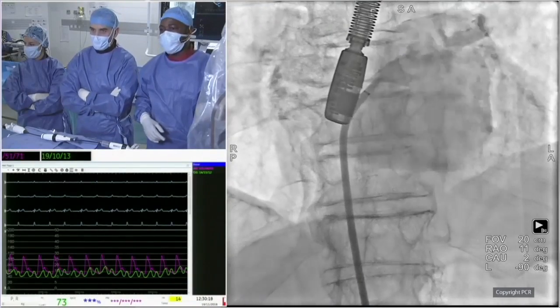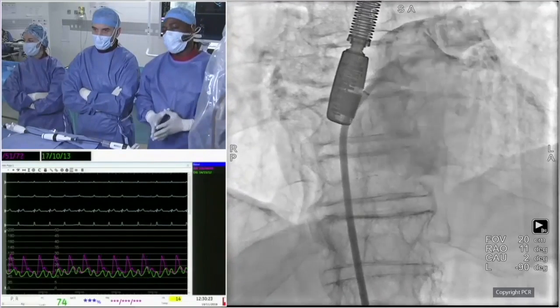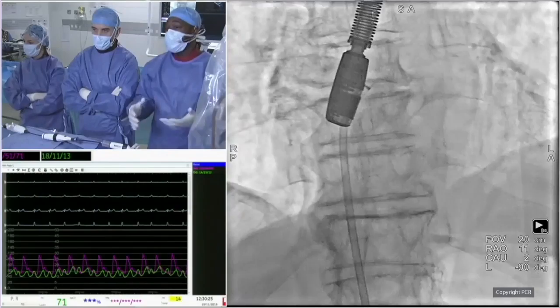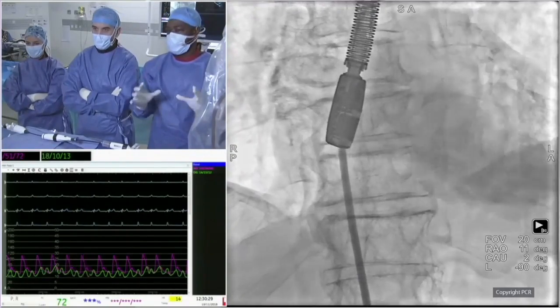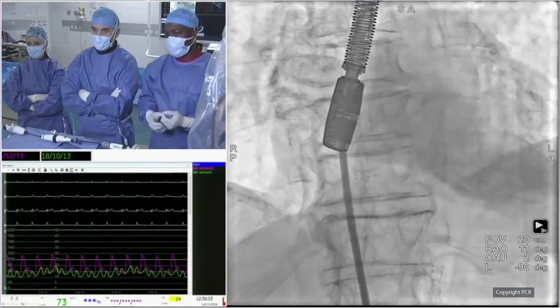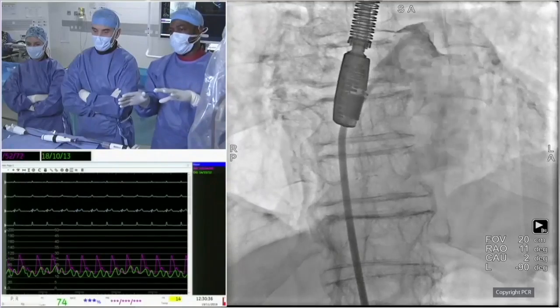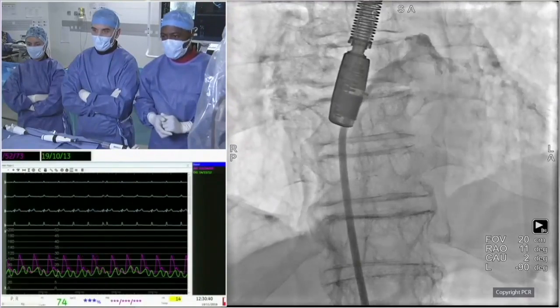So that's something that I've learned from Nicolas when he joined us here. Just after the transeptal puncture, we provide contrast to the patient. It's not a big amount of contrast, about 10 cc's. It's going to fill in the left atrium, and you better appreciate the fluoroscopy projection of the left atrium, and be sure that you have plenty of room to navigate. And it seems to be the case here. So we are quite satisfied.